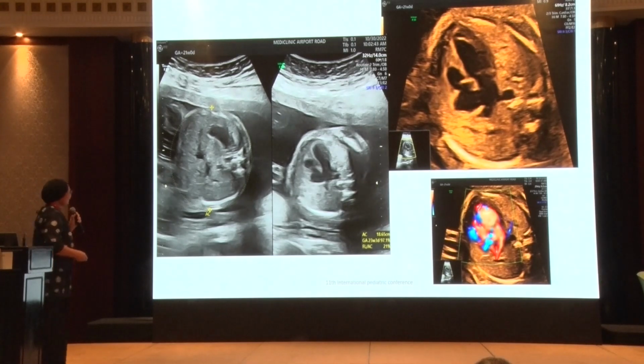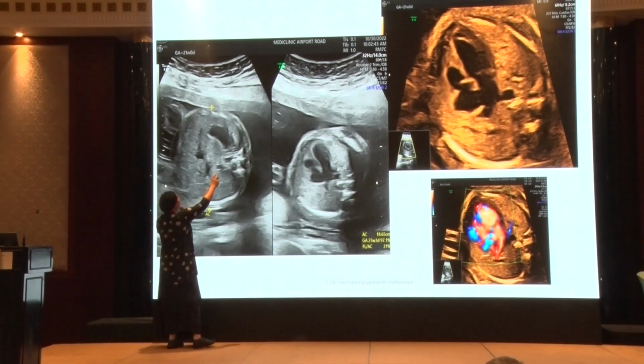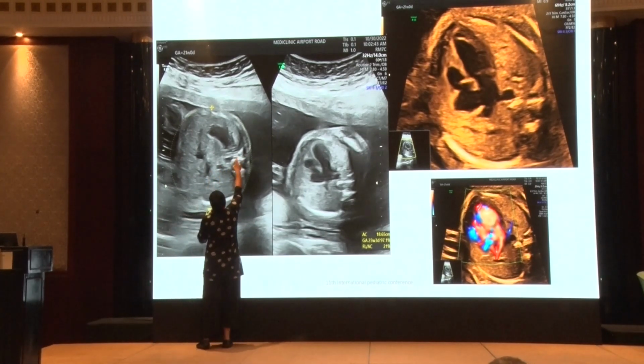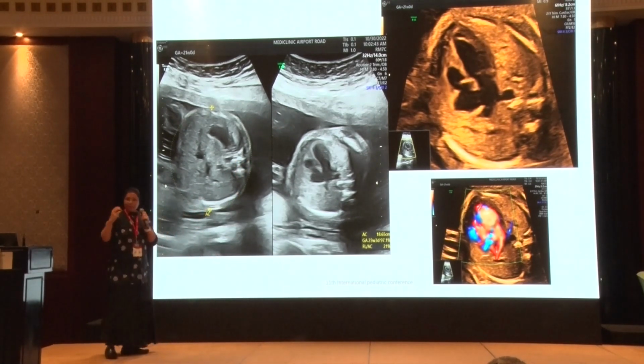Okay. Here is the situs. So the most important, as Dr. Diana was mentioning, you can see, I like the term Dr. Suleiman mentioned: the spine is the center, the heart. This is very important for us to understand.